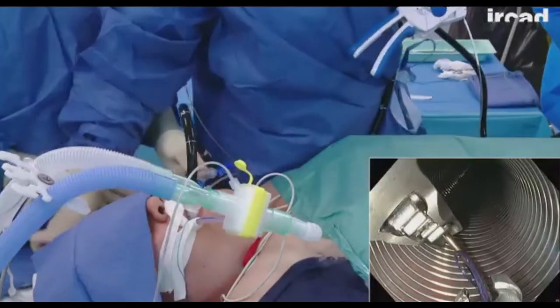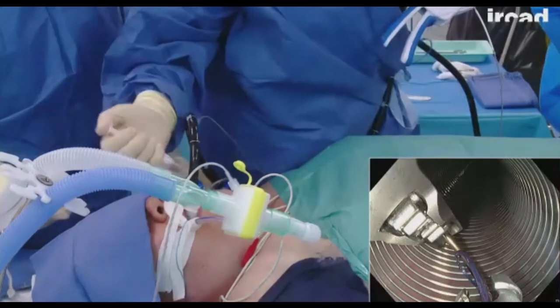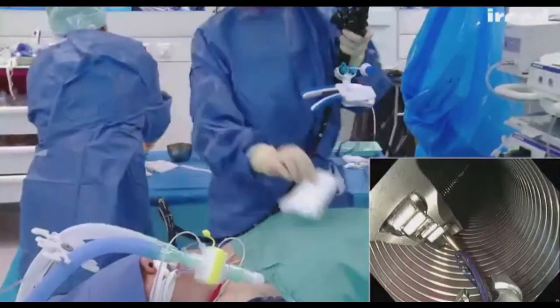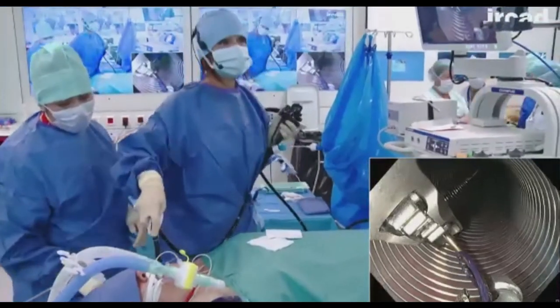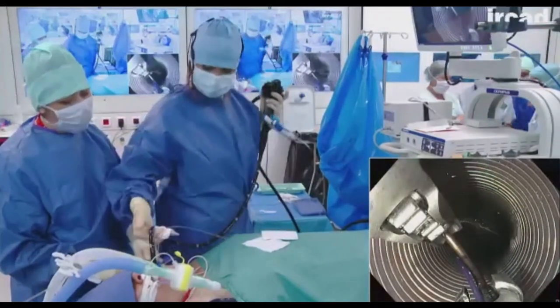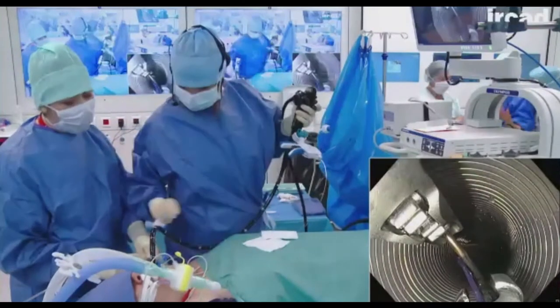and now we'll ask Rita to put some gel in the tube to facilitate the introduction. It's a good idea to put the gel after the scope and the camera are inside, so you're not gonna have any smudging. This is a trick that I learned from Manuel. So Manuel, thank you very much. It's very useful.